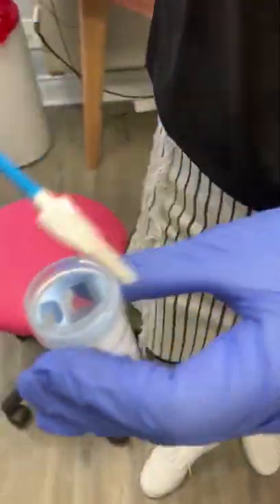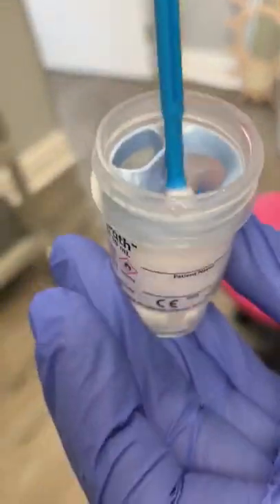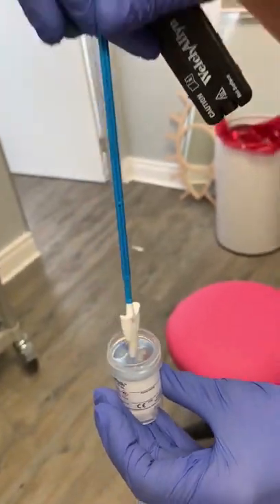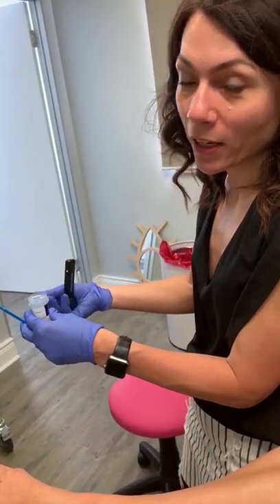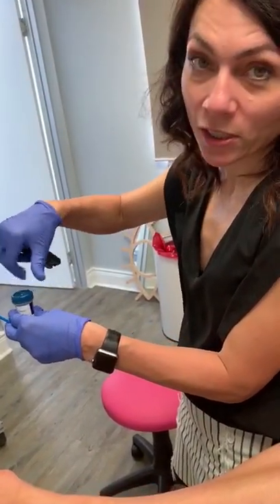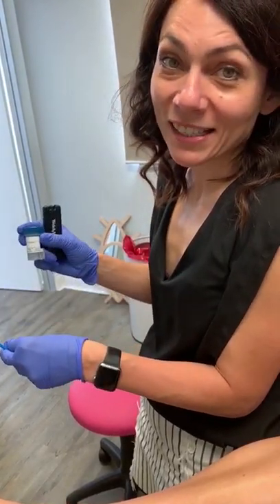It's done. Speculum comes out. As you can see there is no screaming — super simple. It goes into the pot and this will go to the lab. We'll get a result on abnormal cells and on the presence of HPV virus, which causes the majority of abnormal cells in the cervix. And that's done.